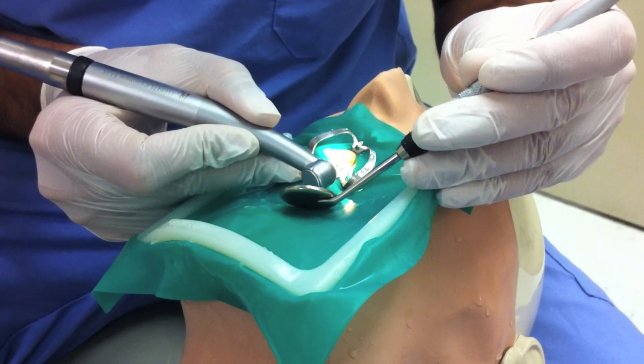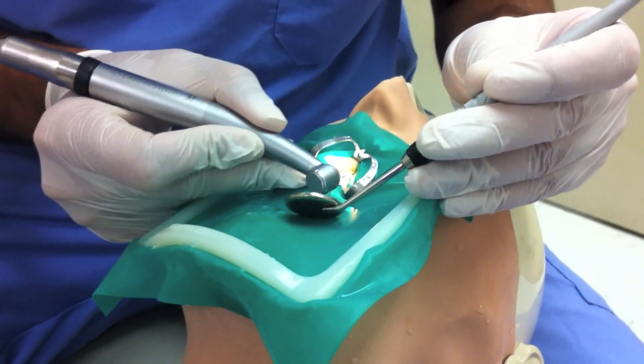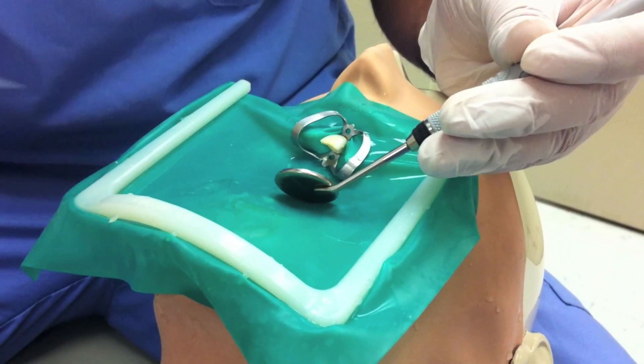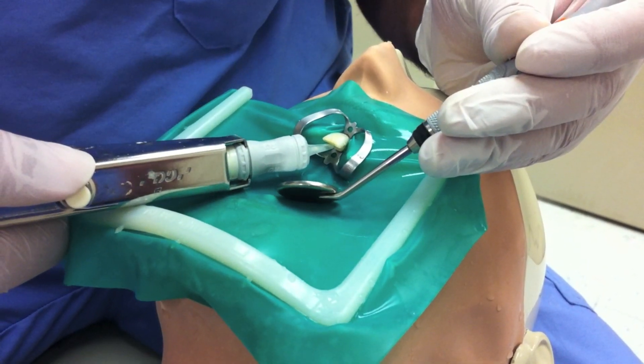Two to three millimeters of gutta percha is removed apical to the CEJ. A protective base of glass ionomer is placed of similar thickness.